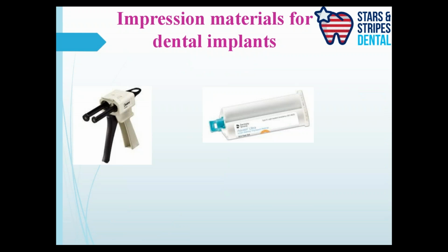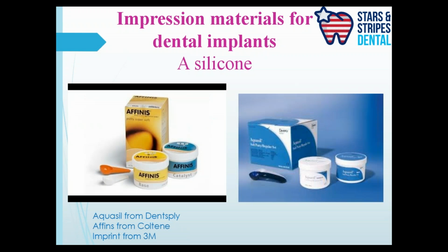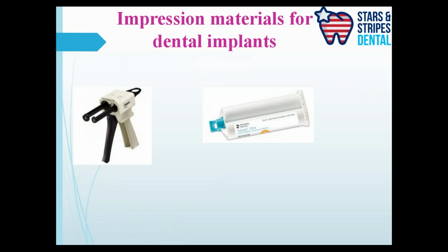Now it comes in two formulas, like the previous one we showed you here. Sometimes it comes in the heavy body material. It comes in the putty and the wash combination format. The medium body comes in the syringe format. So you can have the tools to dispense the material, because we all know that when it comes to base and accelerator syringes, you have to make sure you follow the proper ratio to mix these materials.